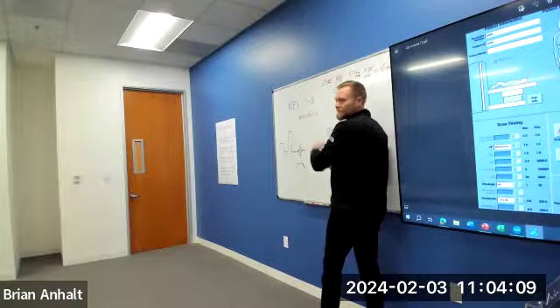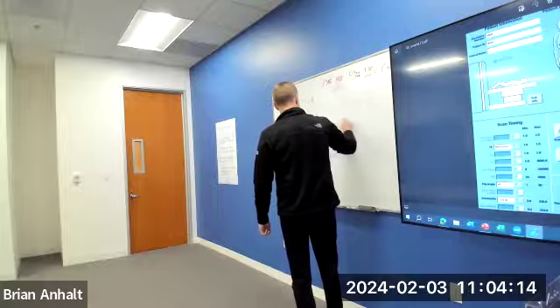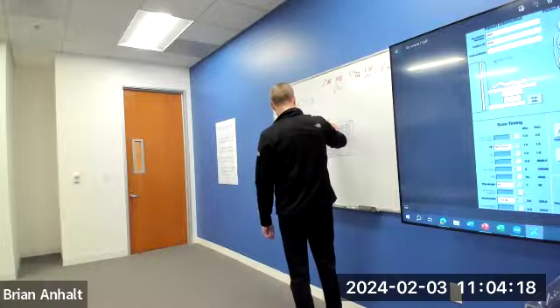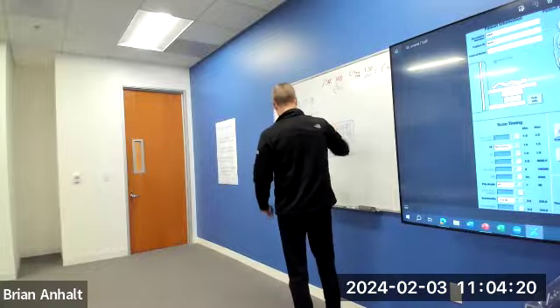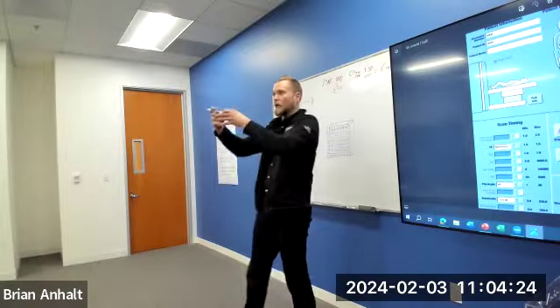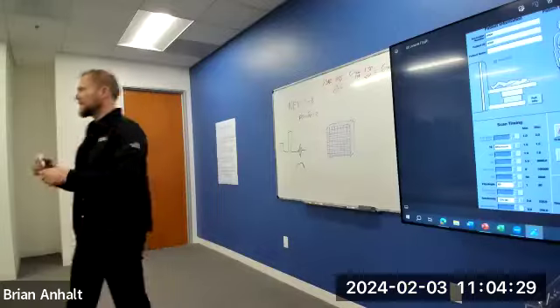And then also, remember this pizza is real, so it has some sort of thickness too. That is a dimension as well. That thickness of the pizza is going to determine how thick each one of those slices are. It's going to determine the volume of each slice of pizza. Deep dish pizza, we'll call it deep dish pizza.